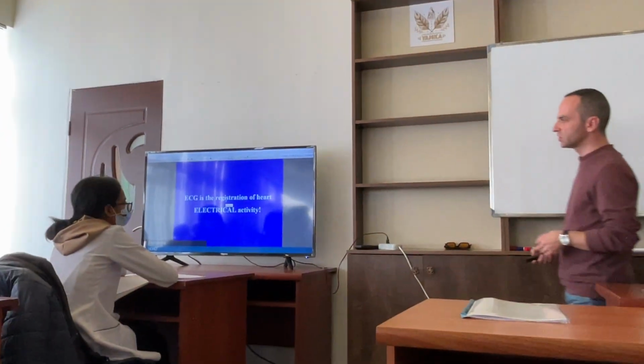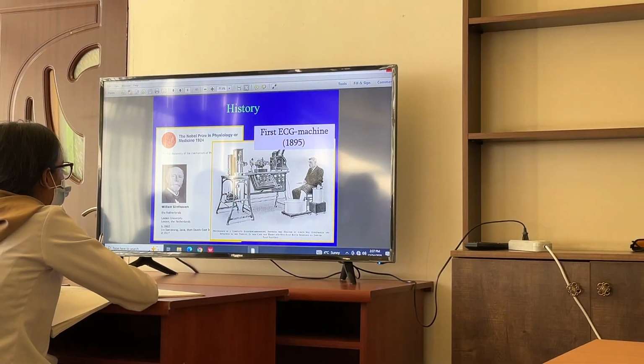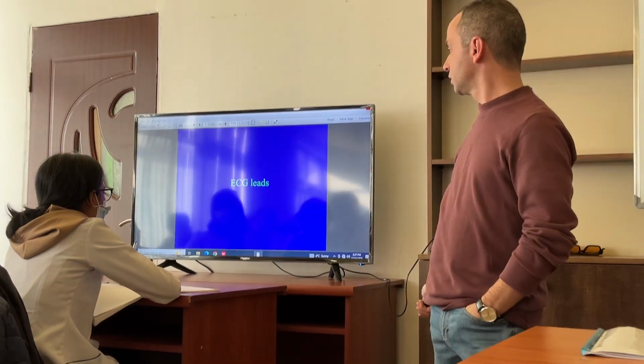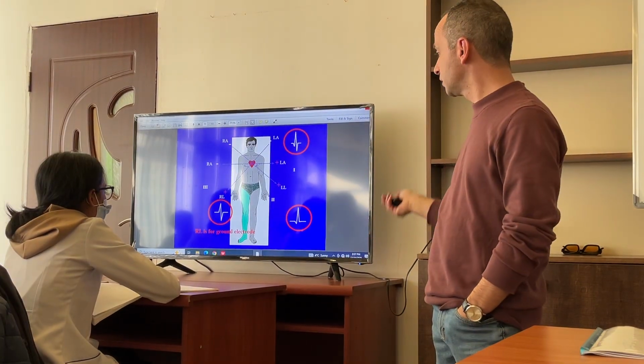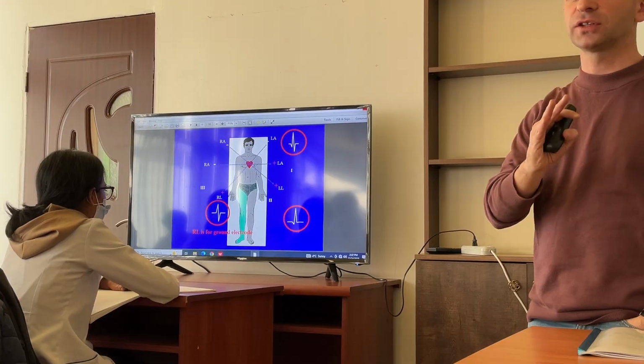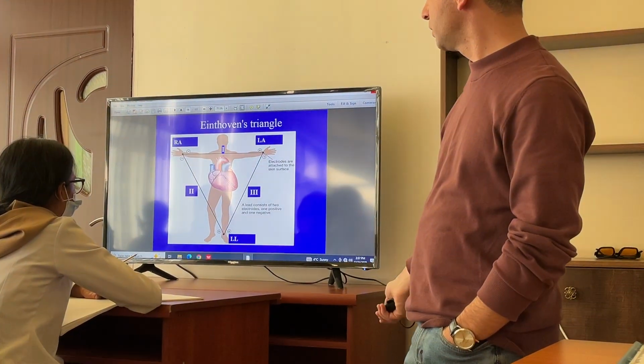So, what is ECG? History of ECG. This we have done. I have explained which indications for ECG. Leads we have explained. Right leg always is for earthing, ground electrode. This I think should be no problem.